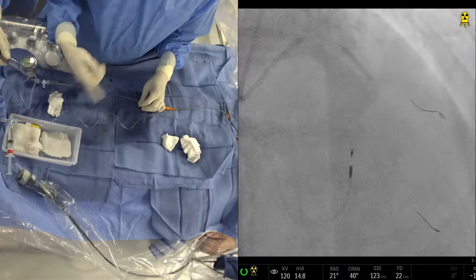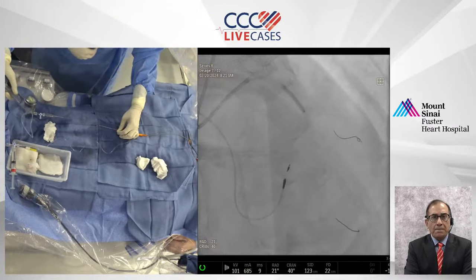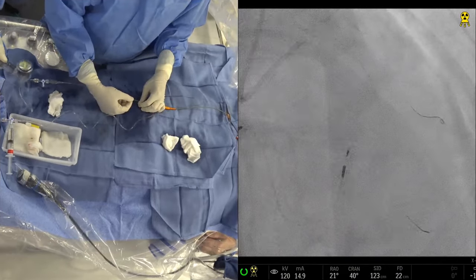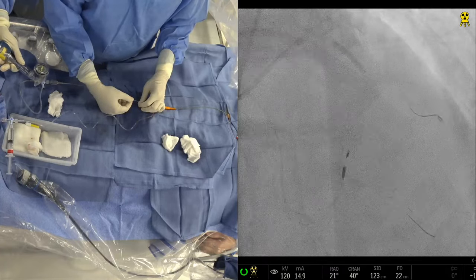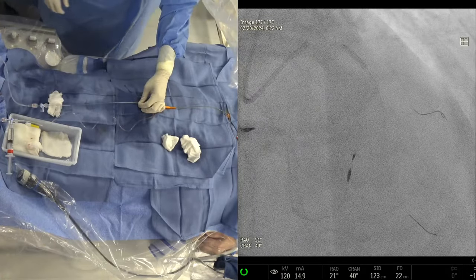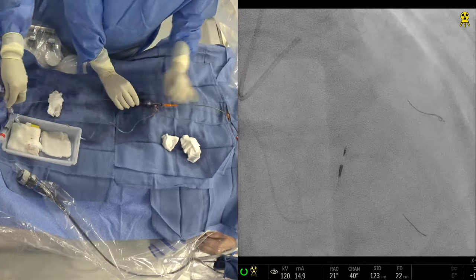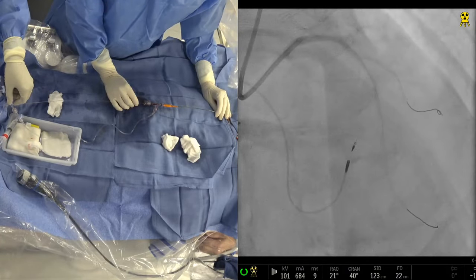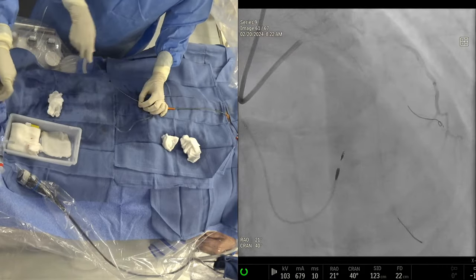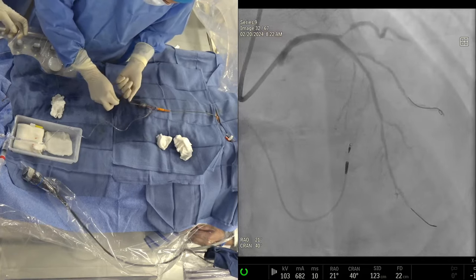A question from Dr. Nikhil Jha. What about doing FFR for the second diagonal? Down. Yeah, I think, based on those trials, at present, decision making based on the FFR is no longer practice. Now, after your stenting, whether you should do an intervention or not, and trying to wire the side branch and see the results, is a different story. But in these kinds of lesions, even if there were 60% at the ostium, after main vessel work, like here, see, it became significant right there. Very significant lesion at the ostium, you can see it there.